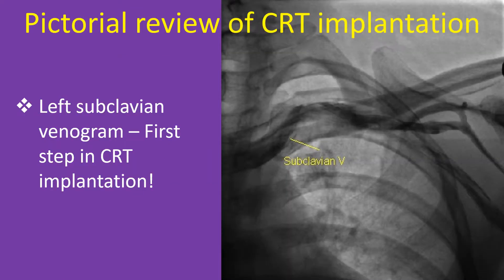Left subclavian venogram is usually the first step during the implantation of most cardiac implantable electronic devices. Iodinated contrast is injected into a left forearm vein and live fluoroscopy images captured for use as a roadmap during percutaneous subclavian vein puncture for the introduction of intracardiac leads. Patient position on the table is not changed after acquisition of the venogram so that the roadmap can be used for fluoroscopy-guided subclavian vein puncture.